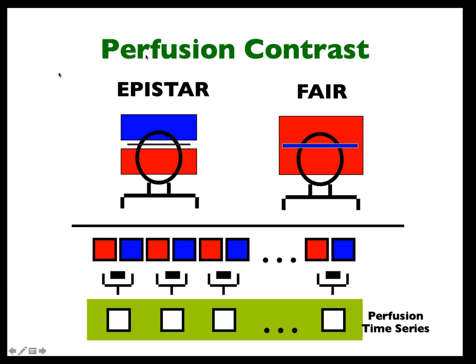One of the pioneers in perfusion imaging was Alan Koretsky and his group. It came out about the same time as BOLD contrast, about 1991. Basically, it involves giving a tag pulse and alternating that with a control pulse to control for RF effects, like magnetization transfer. Any blood that was tagged with an RF pulse that flows into the plane you're interested in will enhance or affect the magnetization or the signal there. So you can get nice maps of perfusion.